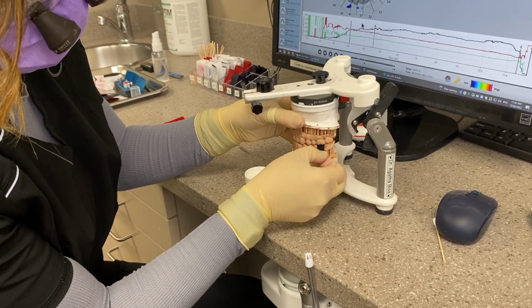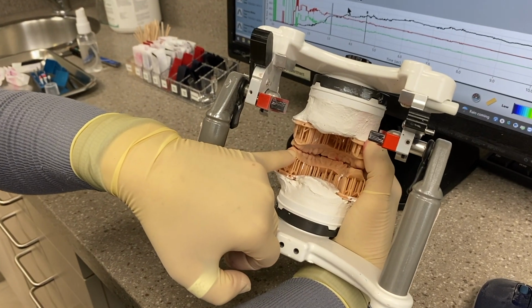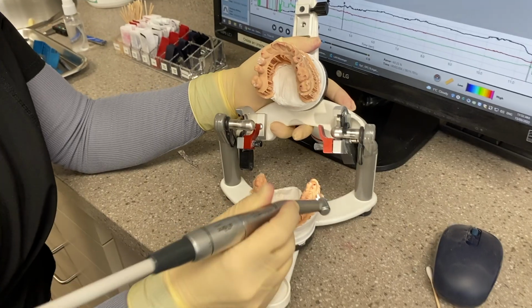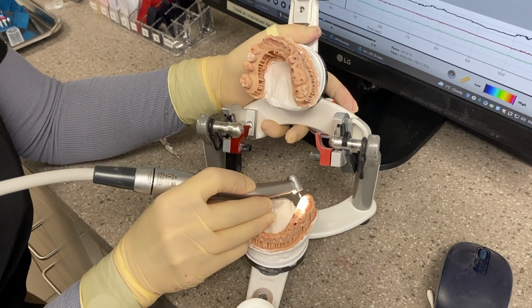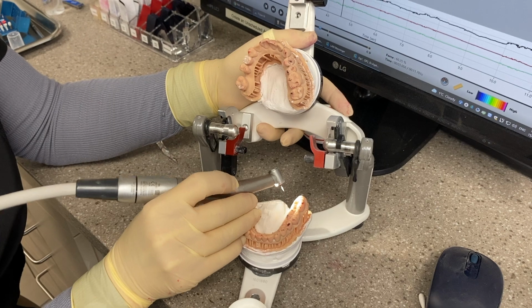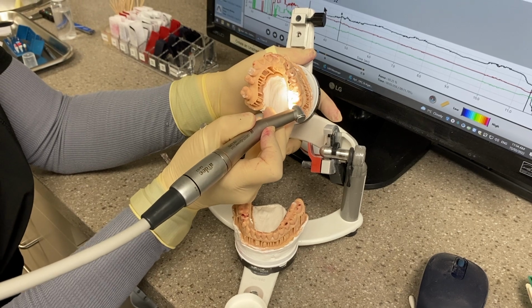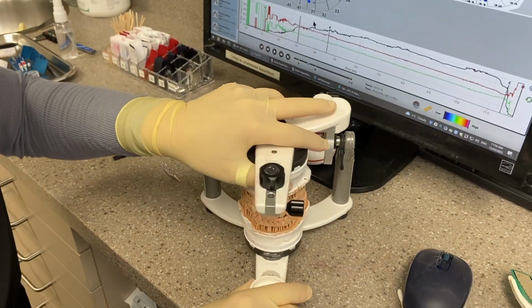And that one's clear. So, lingual cusp of the lower molar is interfering with that slide. You can see that there's like a slide on there. We don't want that slide. We actually don't want lingual cusp hitting on the lowers, but I am going to tuck in that palatal a tiny bit. Okay, so let's check that out again.